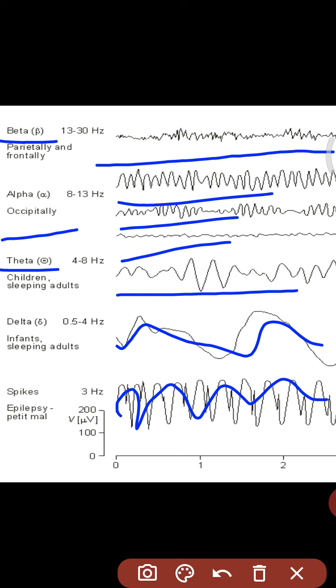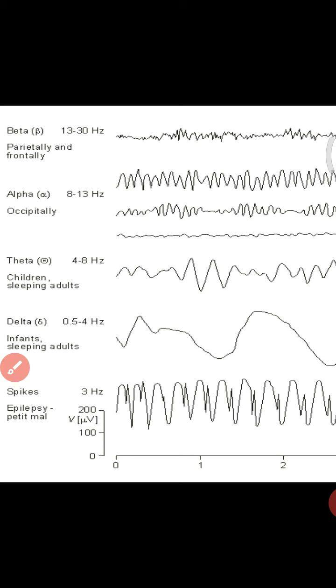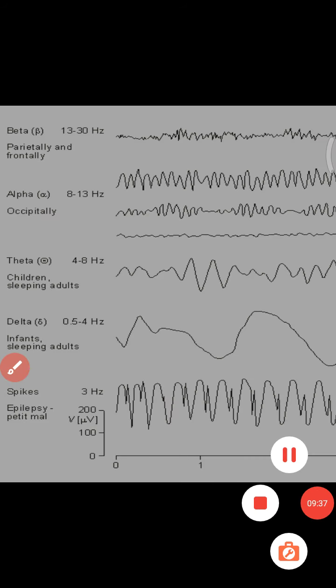Another important point is that electroencephalography is used for examination of epilepsy, brain damage, brain tumors and other organic brain injuries. There is also occasional use of electroencephalography for determining the level of consciousness, that means the depth of anesthesia. So it can also establish the depth of the brain. This is the major concept of electroencephalography, which is very important nowadays in hospitals. Now this is your final concept of electroencephalography.